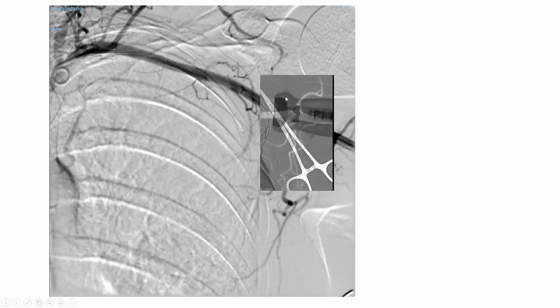I position either a hemostat or more typically the ultrasound probe in that area. So I position it and I take my hand off. I see if I position it appropriately. I keep moving it until I get to the right spot. Then I stick without live fluoro. So I use the fluoro to guide me, tell me where I should put my ultrasound probe and my hemostat, and I stick in that area without live fluoro.